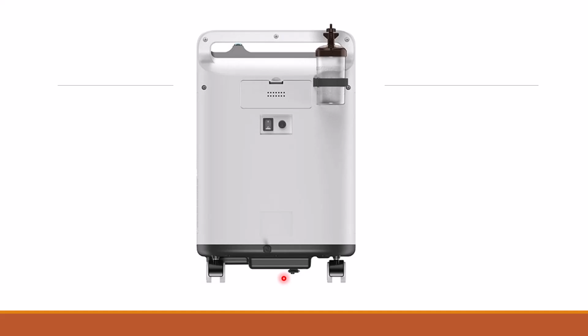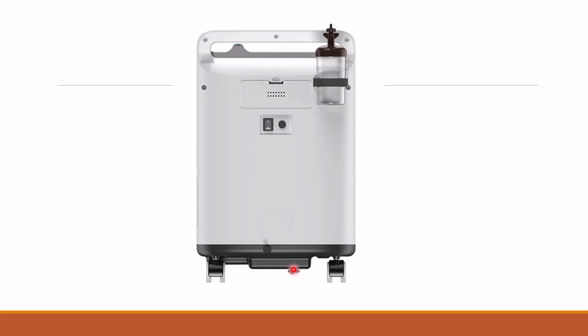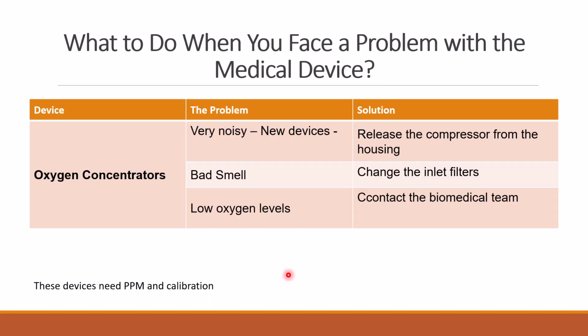So it's very important for you to understand this issue. It's very noisy with the new devices. Release the compressor from the housing. Here you have a rope or something, you have to cut it, and after that everything will be good.